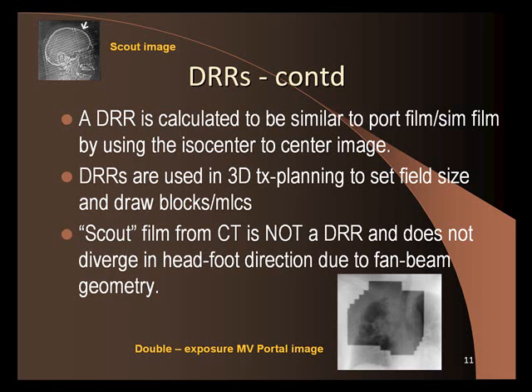So what we'll say is, okay, the doctor will look at this and say, it looks like this edge is, you can take a measurement tool and say, it's 3 cm from the carina. And then they'll look at the DRR and verify that the measurements are the same. This is important because all of our planning is done on the DRR. And then when we treat the patient, this is actually what we're treating with. So we want this to look like our DRR.